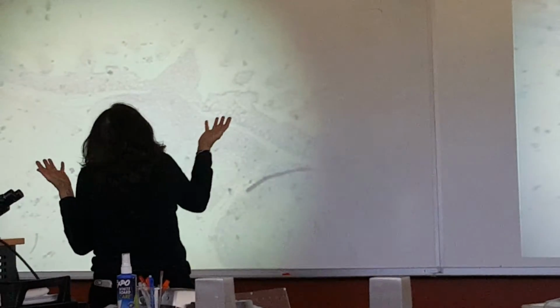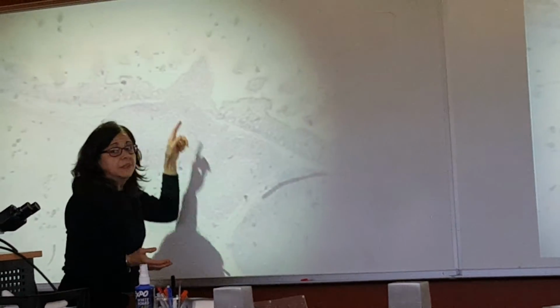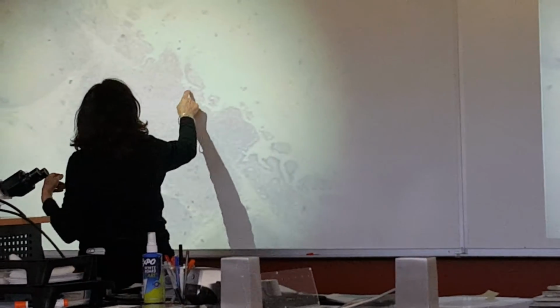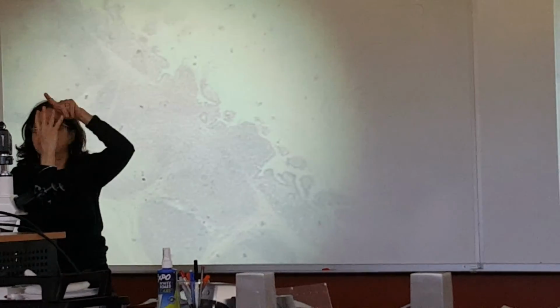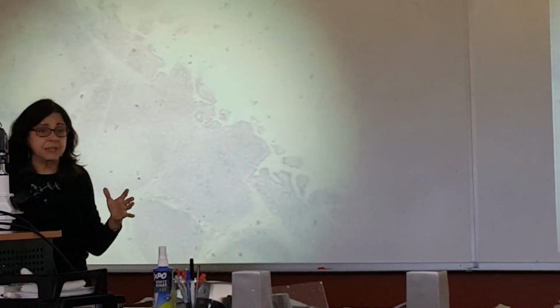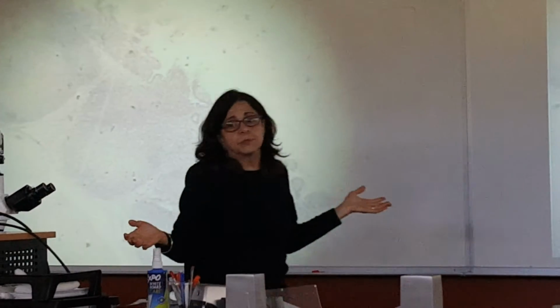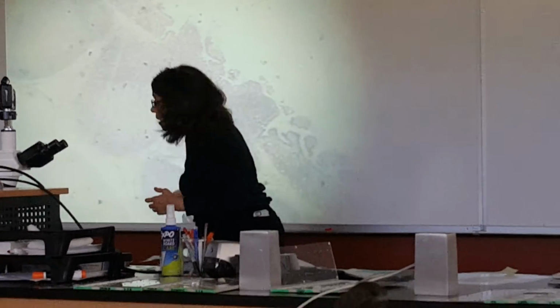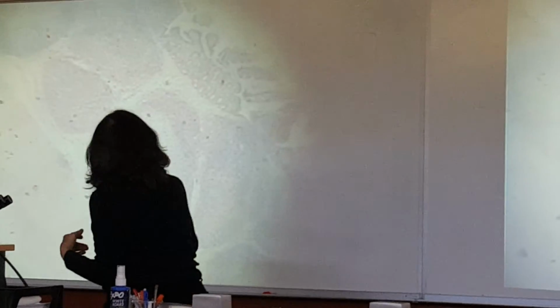So now this is very different from the duodenum you just saw, because villi, so here's one. Okay, there's not a lot. It doesn't look anything like what you saw before as far as villi go. So that's one difference, and that's because by the time you get to the ileum, most everything's been absorbed, so it doesn't need it.